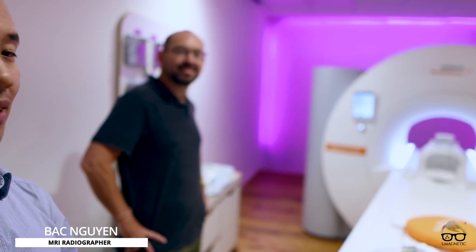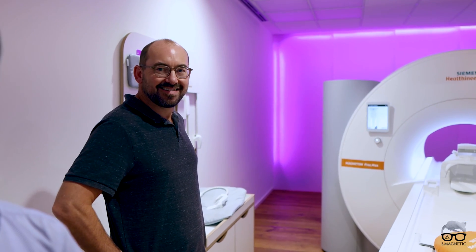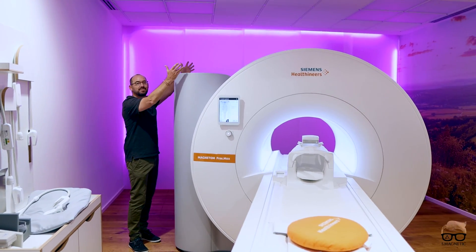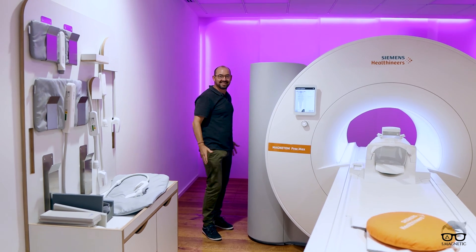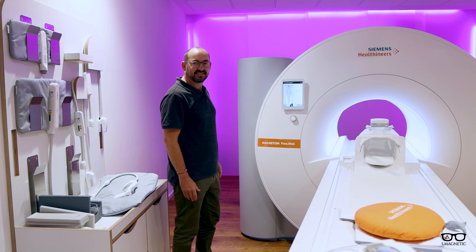So we're inside the scanner now, as you can see. We have the Freemax right there, and Benny is standing here wondering what to do. It's good looking at the scanner. What's missing? Where's the quench pipe, Benny? Let's go — I'm installing it. Is that helium in here? It's 0.7 helium, right? I think so. But there is a CT scanner — it looks like that.